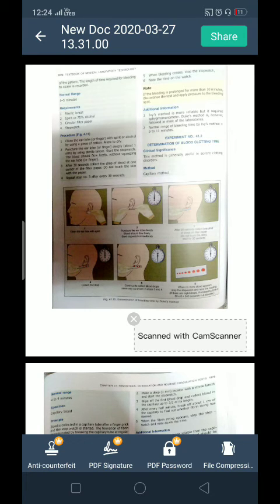And you can say we do this test for checking the proper functioning of the platelet factors, and basically the principle behind this test is when blood comes in contact with a glass surface it will form a clot. जब ब्लड किसी ग्लास सरफेस के कांटेक्ट में आता है तो ये क्लॉट फॉर्म कर देता है.